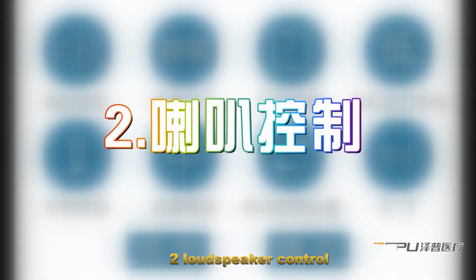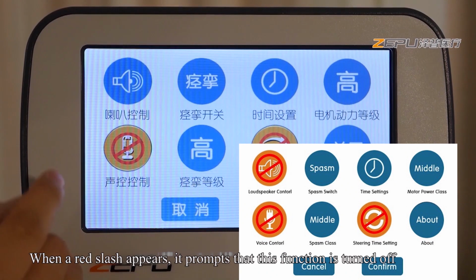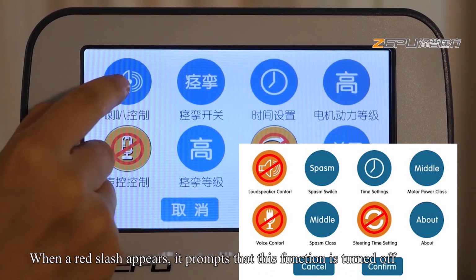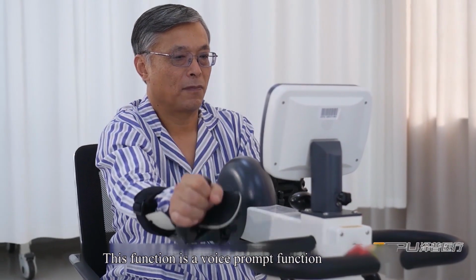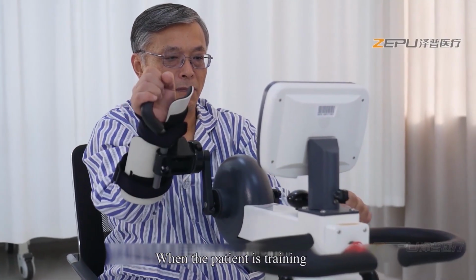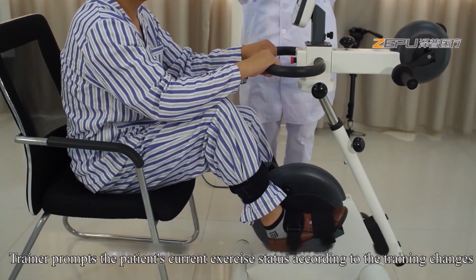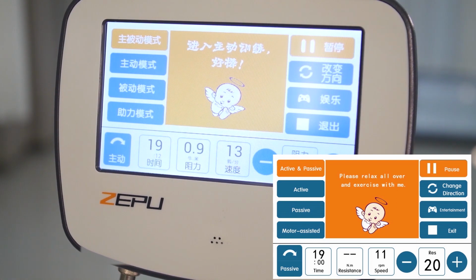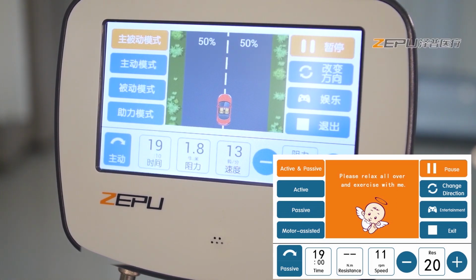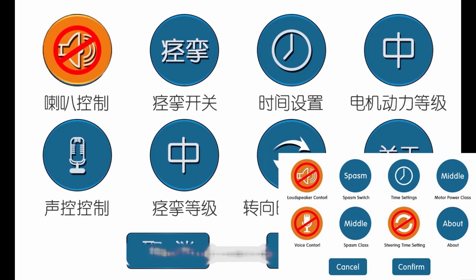2. Loudspeaker control. Click Loudspeaker control. When a red slash appears, it prompts that this function is turned off. This function is a voice prompt function. When the patient is training, trainer prompts the patient's current exercise status according to the training changes. Press the resistance plus and minus keys to change the movement resistance. This feature is off by default. Users can set according to their needs.